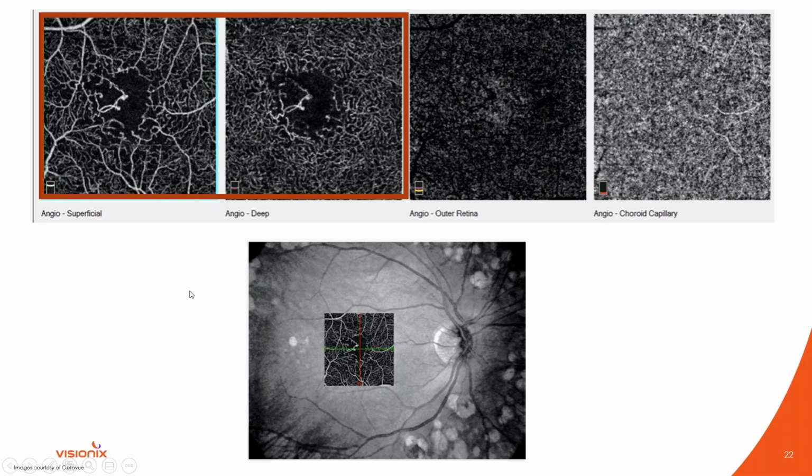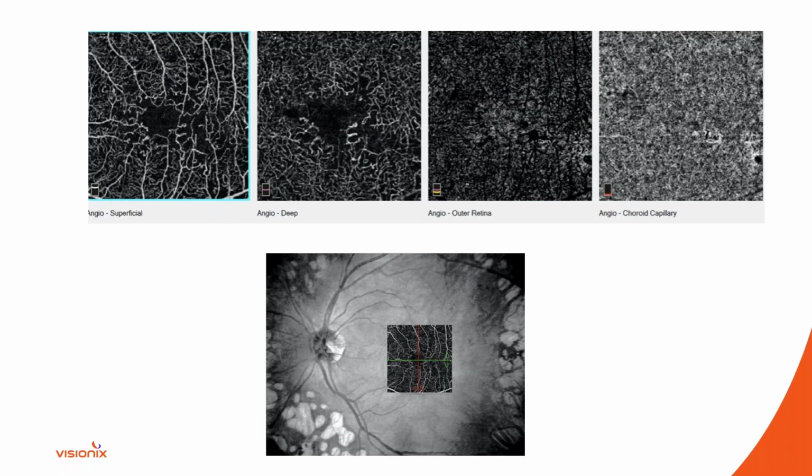So this patient, even though they've been treated and we don't see any, quote, active disease, proliferative or non-proliferative, there's certainly a lot of indication there has been a deep-seated ischemic process in this eye.